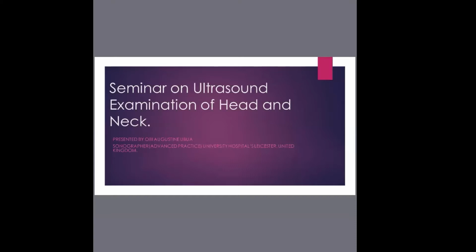Now, the reason why they have that is because something is blocking the salivary gland. So when things like that happen, the doctor refers the patients to you, who is a specialist, and they expect you to give them an answer to what's causing that patient's problem.